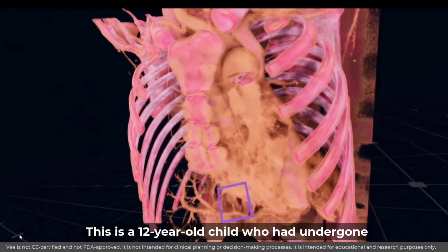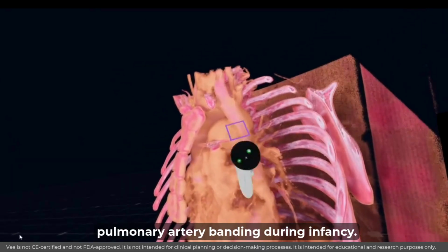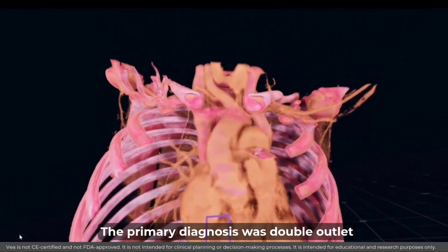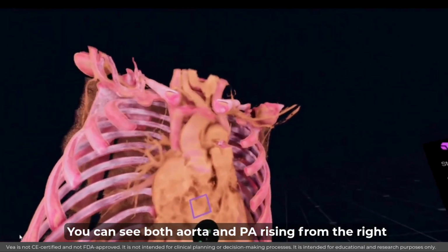This is a 12-year-old child who had undergone pulmonary artery banding during infancy. That's the left SVC, that's the right SVC. The primary diagnosis was double outlet right ventricle. You can see both aorta and PA rising from the right ventricle.